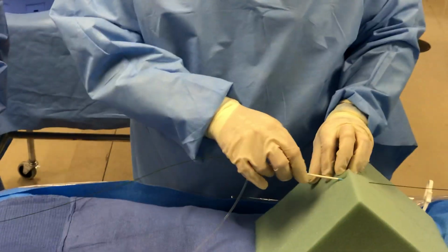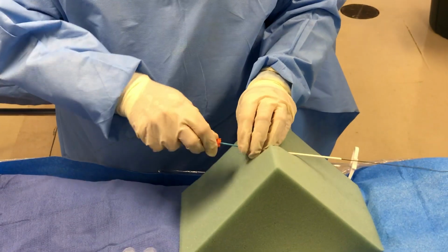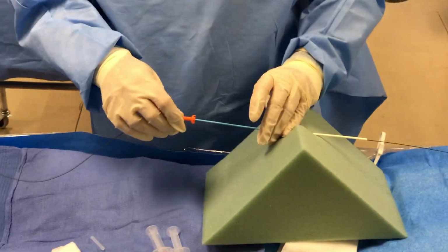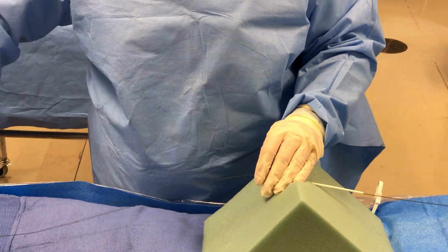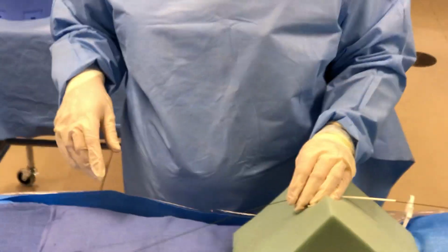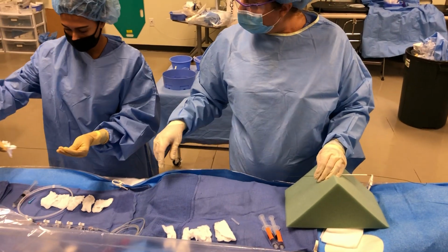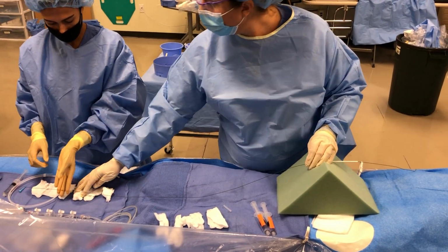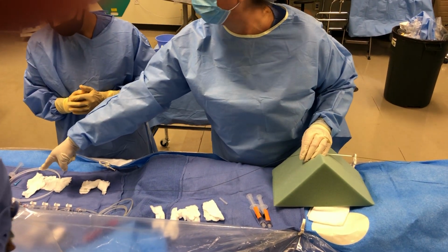Hold some tension on that wire, meaning like a tightrope, but don't pull. We're gonna go in. And then some doctors will just leave the wire in the patient, and then we take the dilator off, wipe the wire again, because there's blood. Lay the wire down. I would throw a 4x4 or something to secure, because that's your problem now.